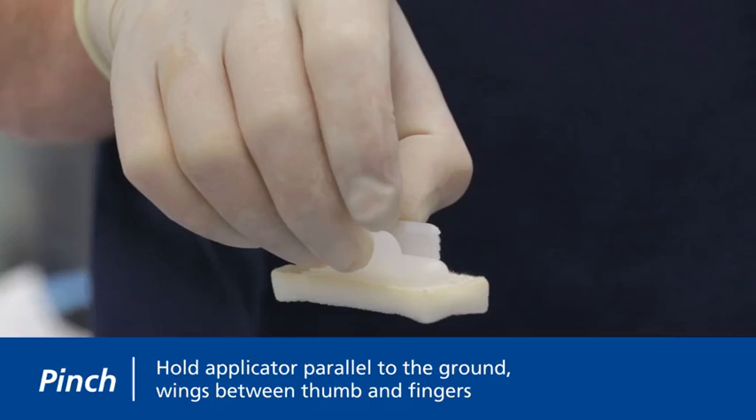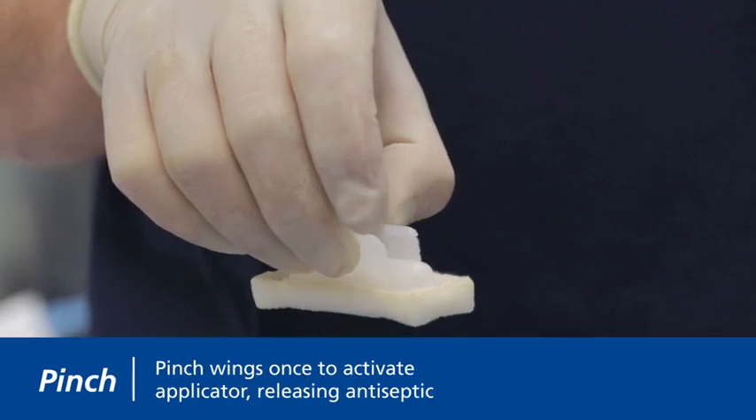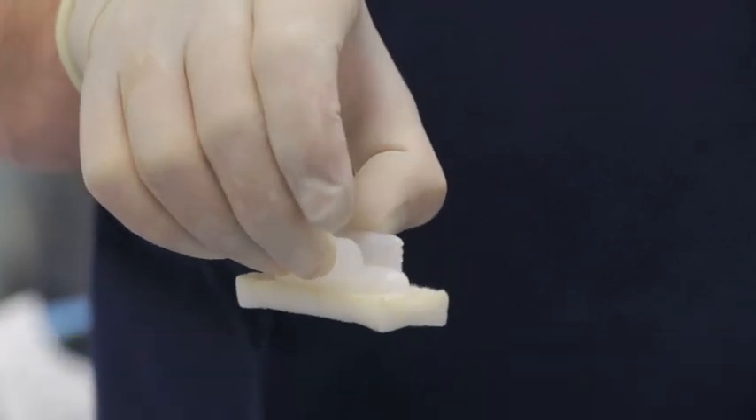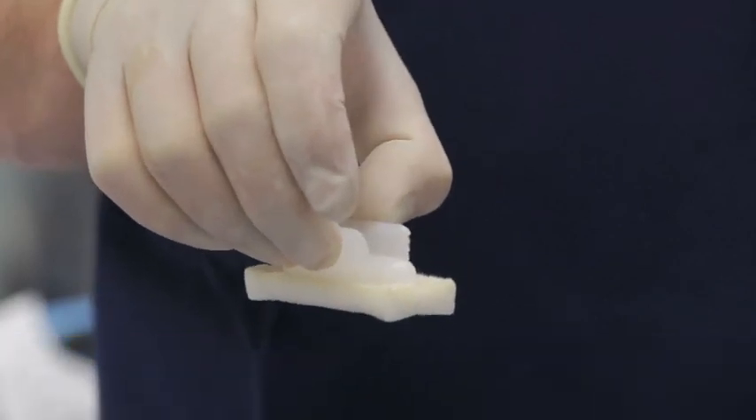This position allows the solution to properly load into the sponge upon activation. Pinch wings together once to activate the applicator. You will hear a pop as the ampule breaks.